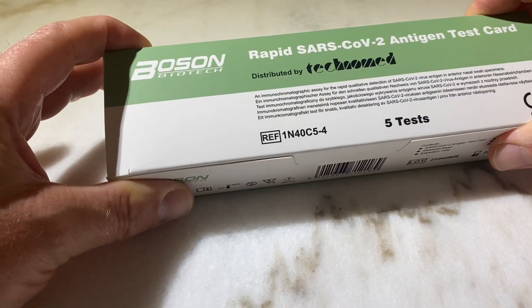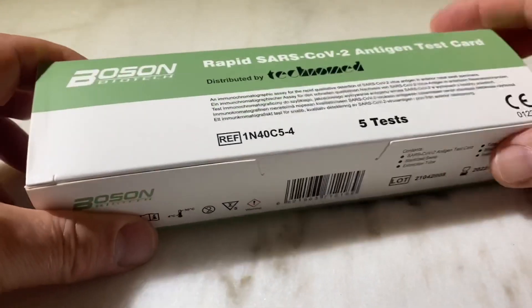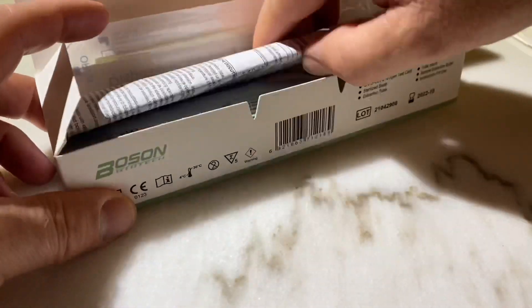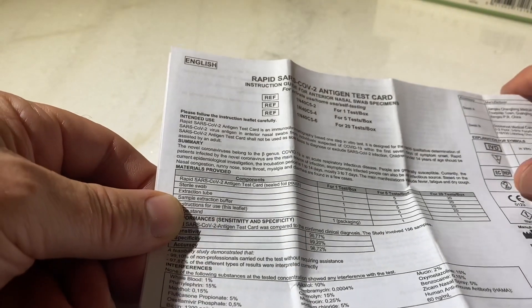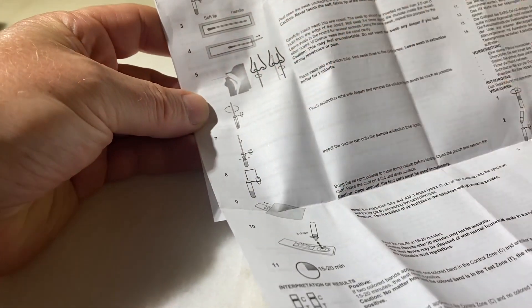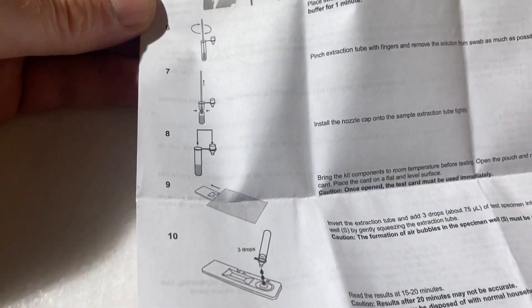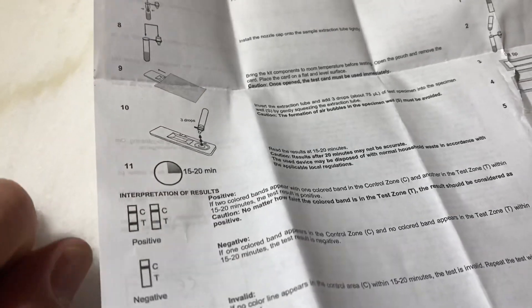This is the Boston Biotech Rapid SARS-CoV-2 Antigen Test Card — they all come pretty much the same. Inside you have the instruction manual, which comes in different languages; here's the English version. This was a kit for five tests, so I can show you on the second test since I've already tested myself once. The instructions come down to a key section: steps one through ten, then you drop your solution onto the card, and that tells you after 20 minutes if you have COVID-19.